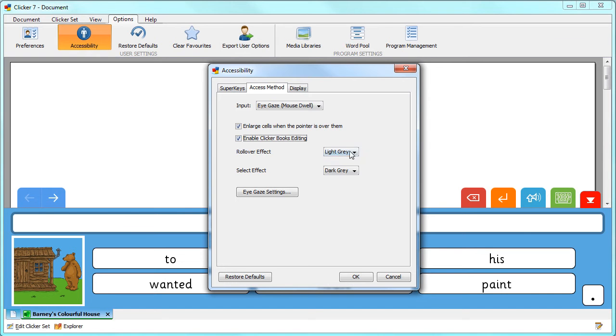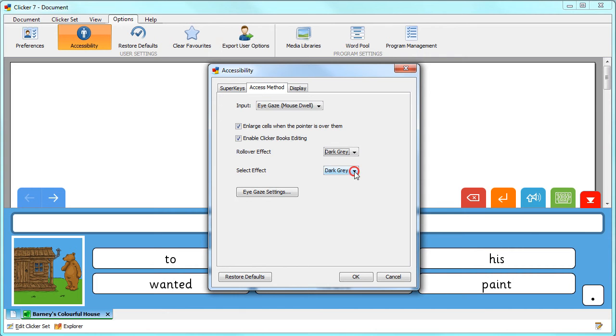Select an effect to help identify which cell the pointer is over, and choose an effect to help identify which cell has been selected.